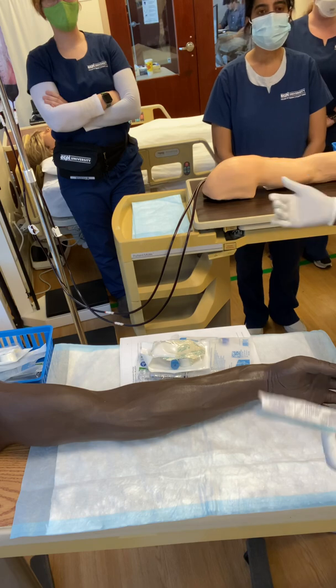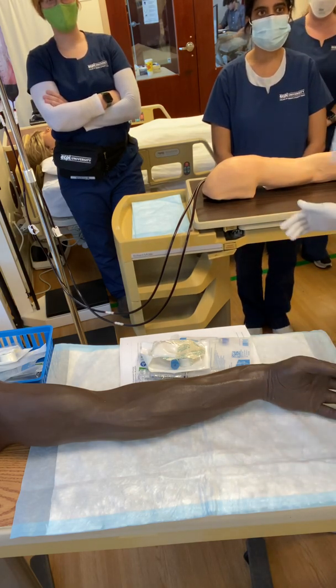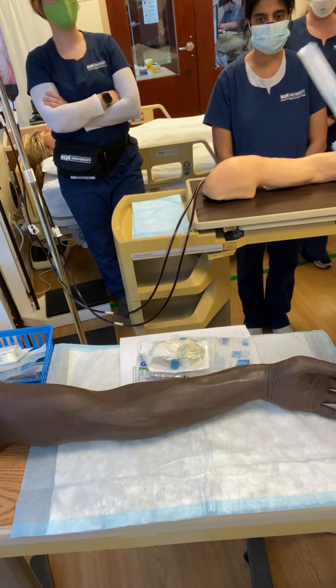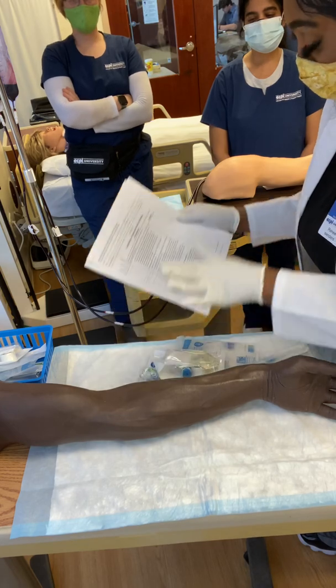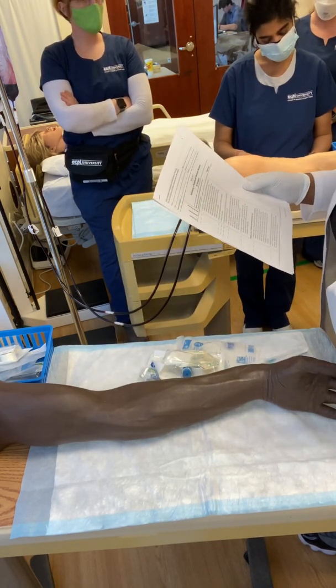when we have men, generally they have those super long veins, okay? So this little 22 gauge is not going to do anything. I never use a 22 gauge. I think it's insulting. I like 18. Okay. All right, so let's keep it moving. And I'm going to try to go up on your sheet. That way you guys can make sure that you're doing everything I'm doing.